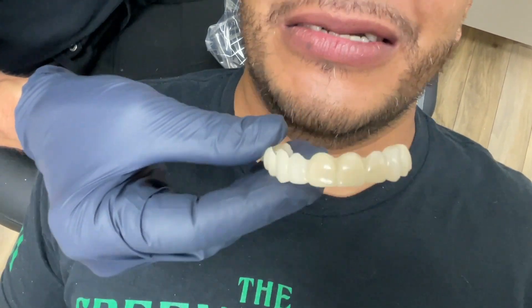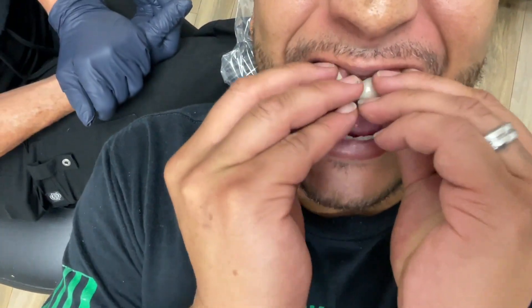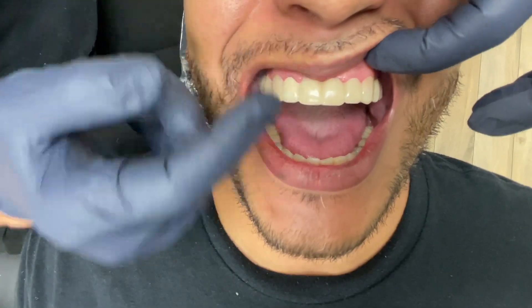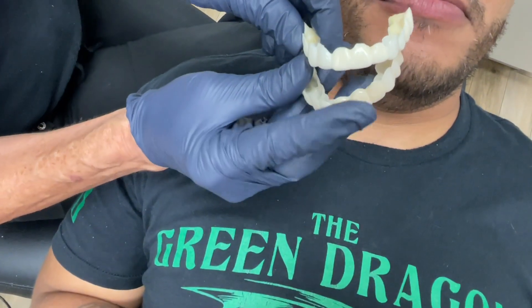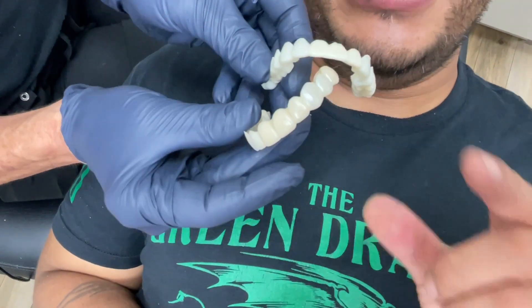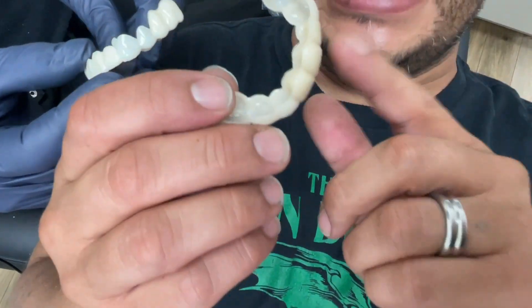You're going to have to put it in because it's hard for me to get in, so go ahead and place it in. He struggles a little, but not much. Go ahead and open. So you can see how this fits — these are more highly contoured than the other ones, but the biggest thing is you just can't eat with the old ones, you couldn't function with them. And these new ones feel like real teeth, while the old ones feel like plastic.